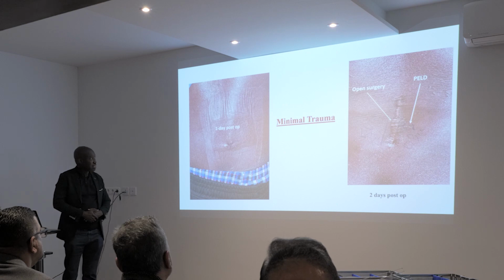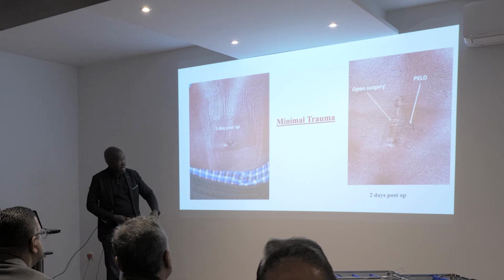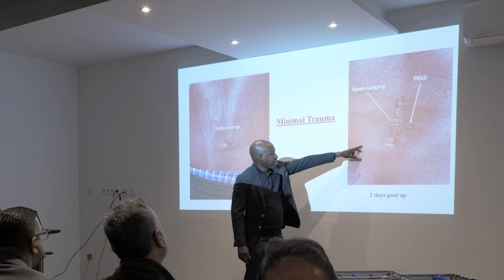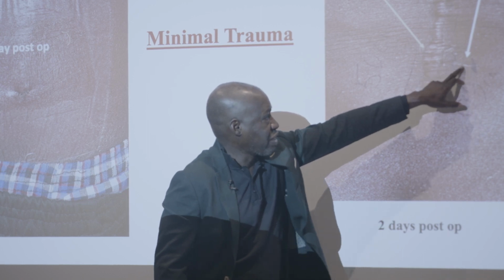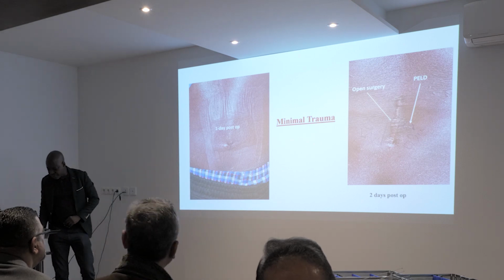We can see here how minimal the trauma of endoscopy can be. Just a day post-op, and in that picture, somebody had open spinal surgery, about 5 centimeters, but the small endoscopic one I did for his reherniation is just 0.9 centimeters.